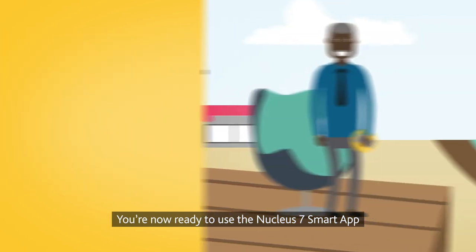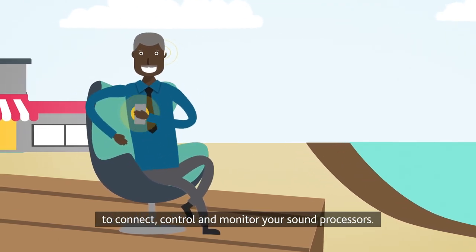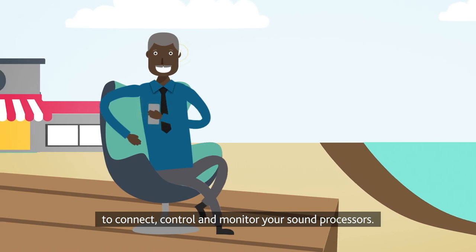You're now ready to use the Nucleus 7 Smart App to connect, control, and monitor your sound processors.